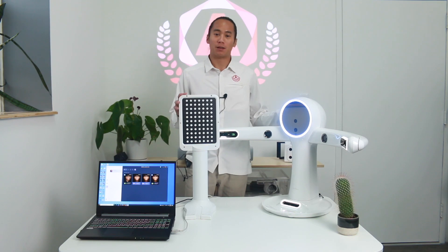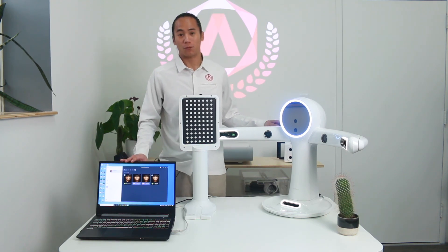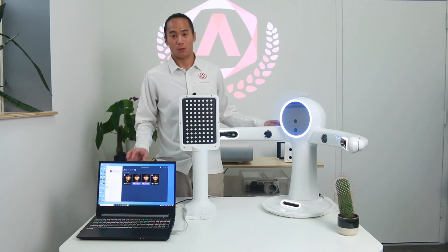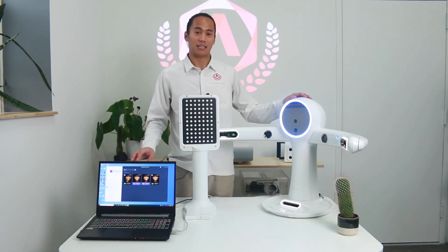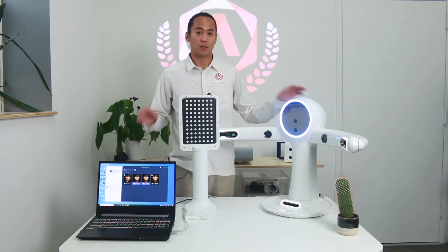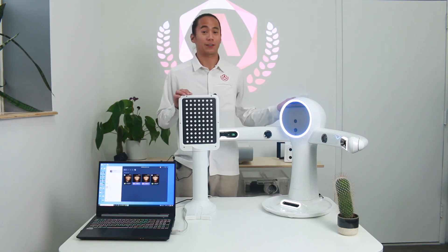Once everything's been plugged in, the first thing we're going to do is install the software using the provided USB. Once the software is installed, we're going to register the scanner and then connect it via the IP address. Once all that has been completed, we're ready for calibration.